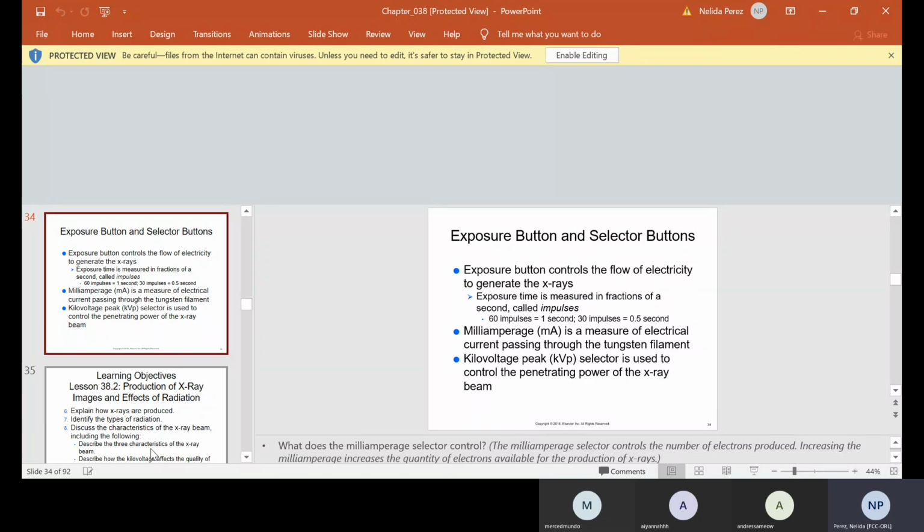And like I told you yesterday, some of you were going crazy on the button, just pressing it a couple of times. You want to press the button, wait until you hear the beep, and then let go of the button. If, once the beep goes, you keep your finger on the button, it will cause an error, and that's where you hear the several beeps. So again, just make sure you press the button and let it go as soon as you hear the beep.